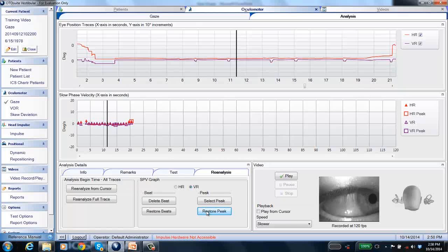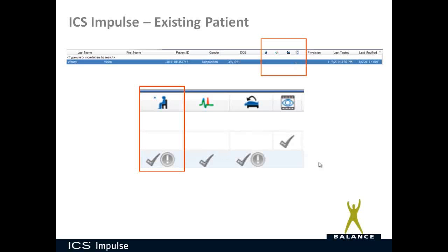When you have an existing patient in the system who has had a gaze test, spontaneous test, or any ocular motor test, there are four icons at the top of the patient file. The icon showing a man in a chair looking at a blue dot is the ocular motor icon. Any ocular motor test — gaze, spontaneous, VOR, skew deviation — will place a check mark next to that patient file if they have ocular motor data saved.